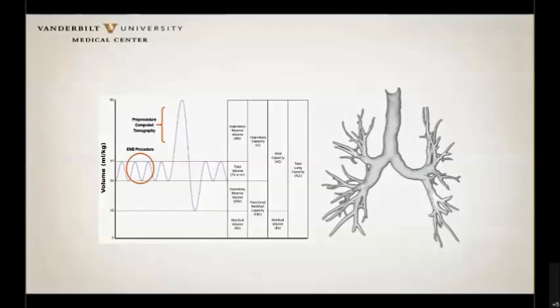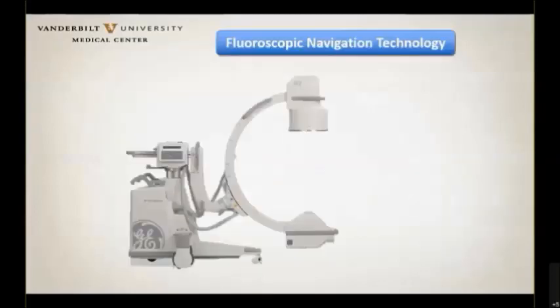And trying to improve the accuracy of the navigation based on the pre-op CT, no matter how accurate you get, is not going to get you there if you're going to the wrong destination. And this is obviously going to be prominently displayed in the periphery of the lung, where you get the more CT to body divergence. This is precisely where we want to go with this peripheral lung nodule.